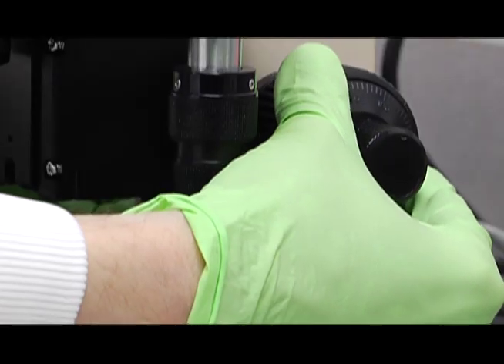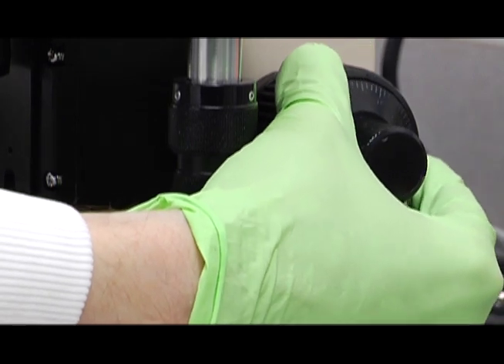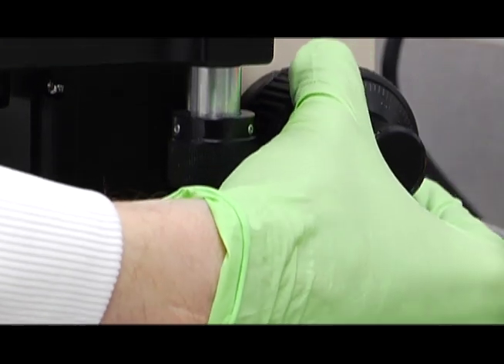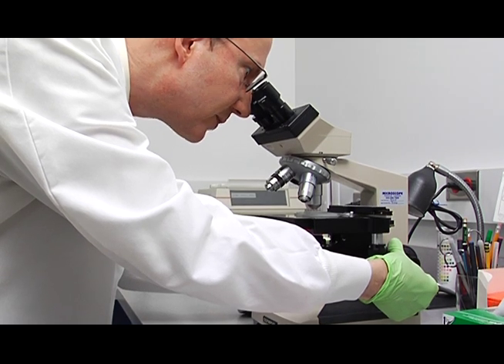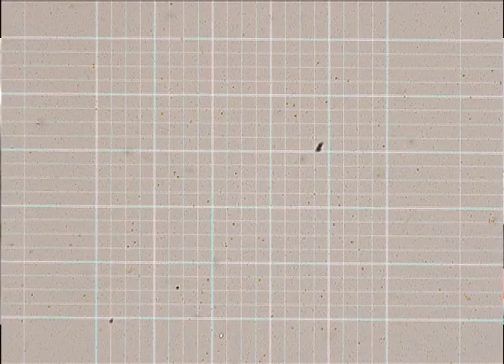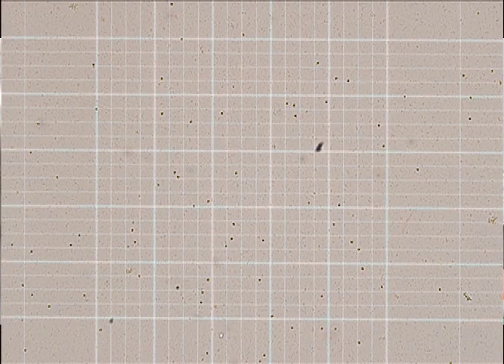Now lean over the microscope. Looking through the microscope, lower the stage away from your objective with the coarse focus knob until the rulings come into focus.